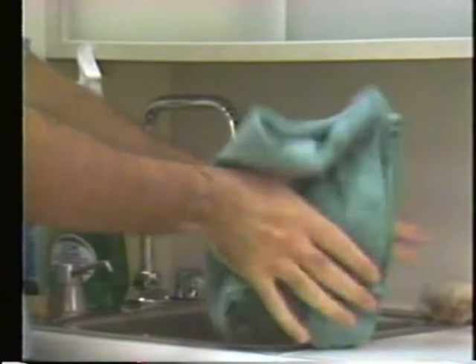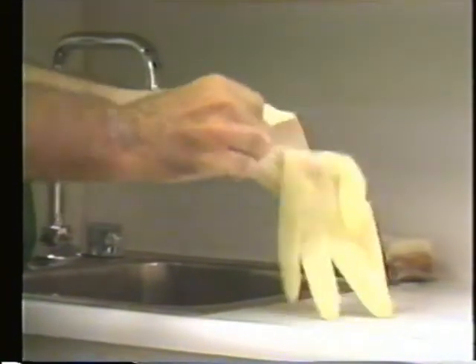When you've presented your case and have been given permission to begin treatment, you will perform a surgical scrub. This procedure begins the local chain of asepsis around you and your patient. With the scrub complete, you will glove and begin treating the patient. Okay, Mrs. Spencer, we're all set to begin treatment.